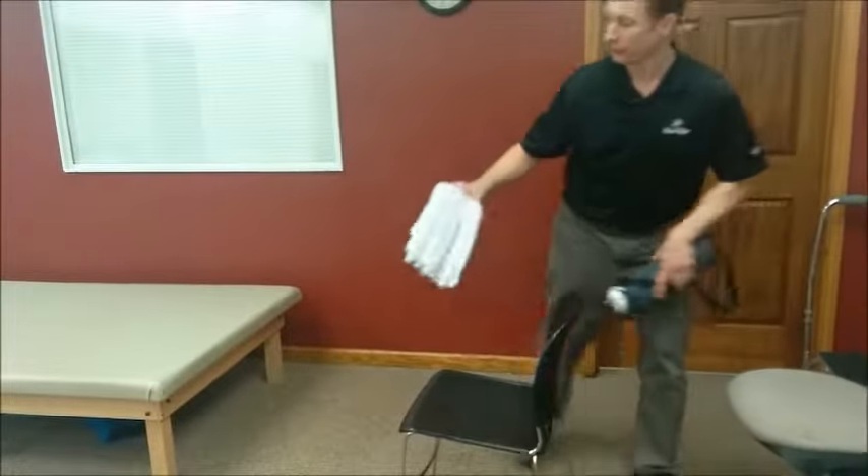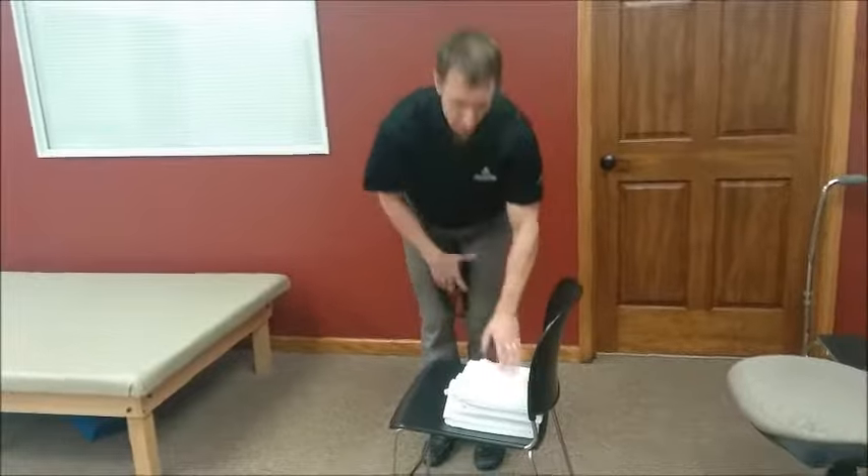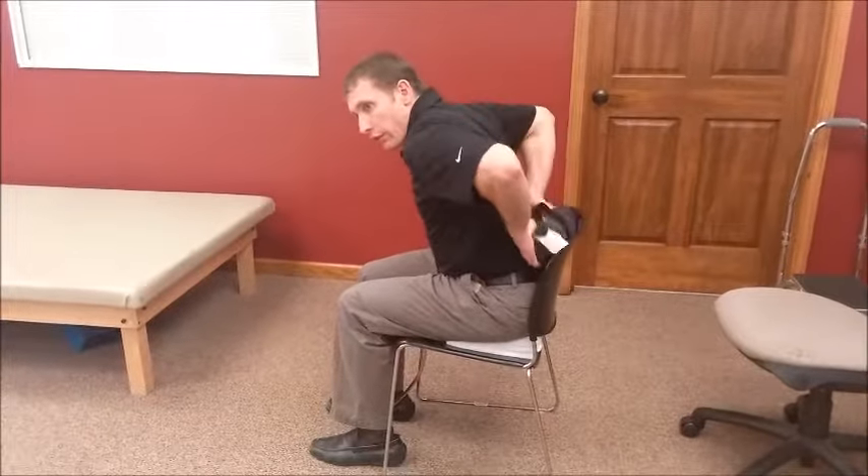One solution, if you can't get a new chair, is to just take some towels, put them at the base of the chair, and now your hips are going to be higher than your knees — so that takes care of that. Your butt goes all the way back again, lean forward a little bit, get the roll in the small of your back, and then there you are. This actually feels pretty comfortable.